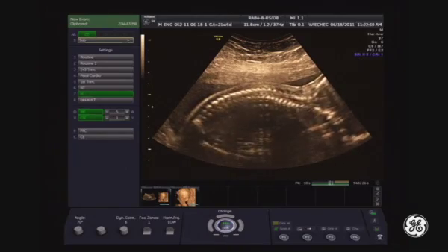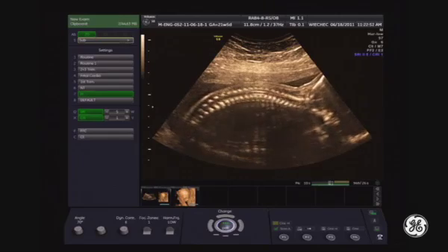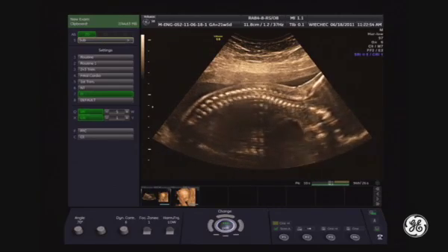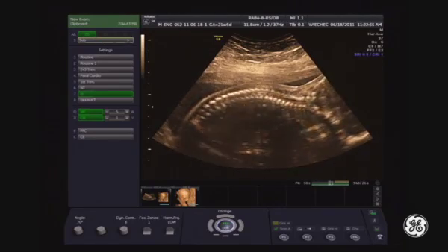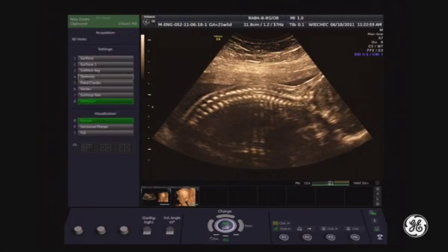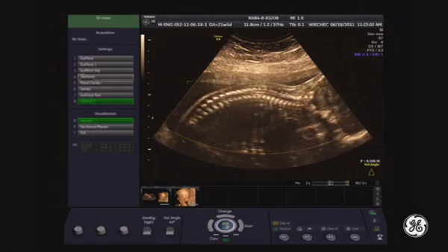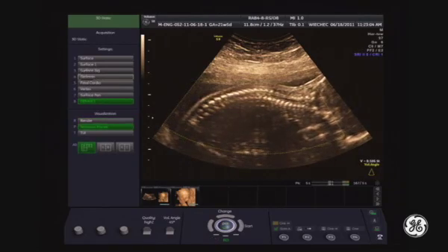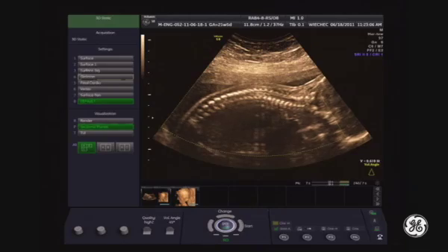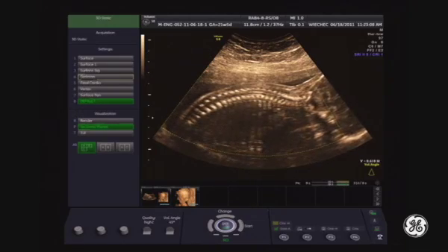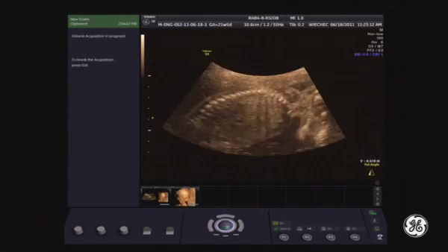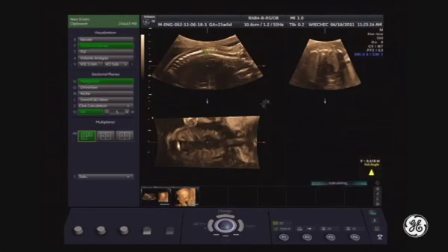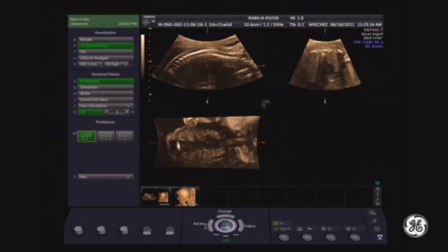This is the rotation and this is the original plane for the acquisition. There are two ways you can do this: static acquisition and dynamic. I will start with static 3D. I select 3D, go to the sectional planes, check if the fetus is quiet at the moment, and release the acquisition trigger. This is the spine acquired by static 3D.